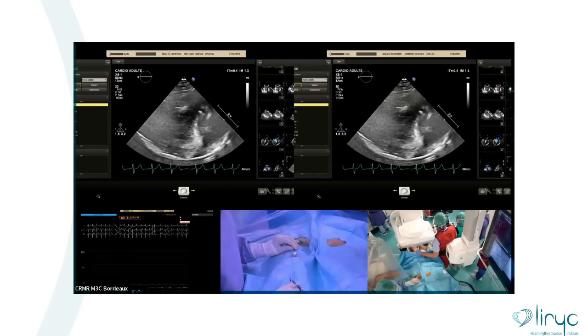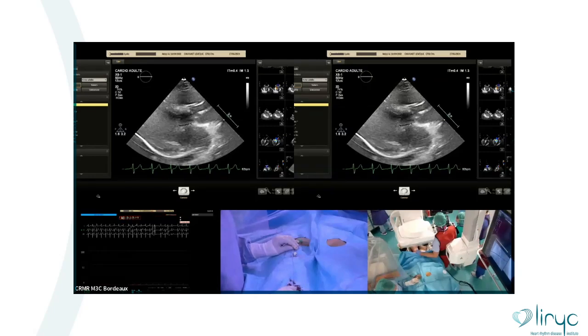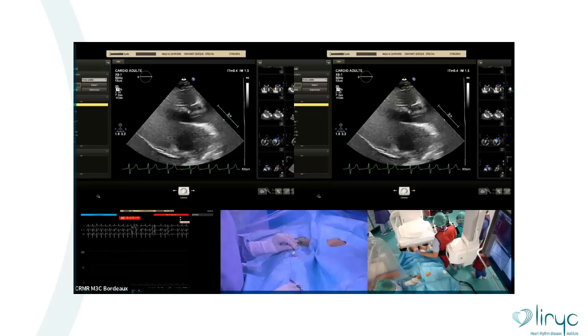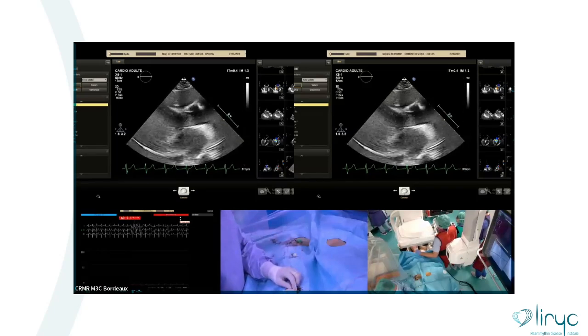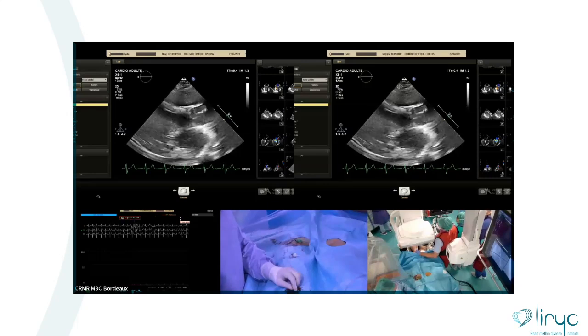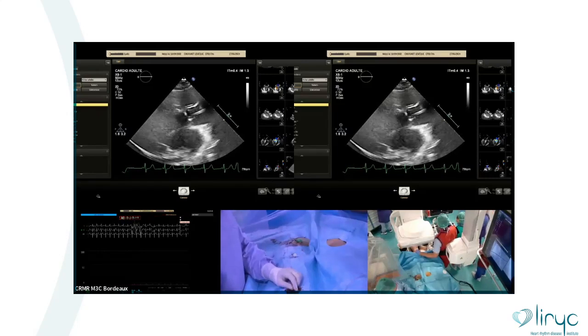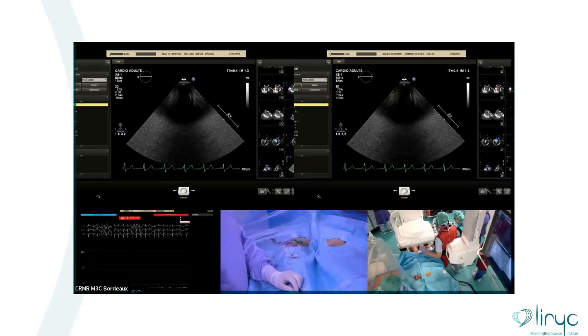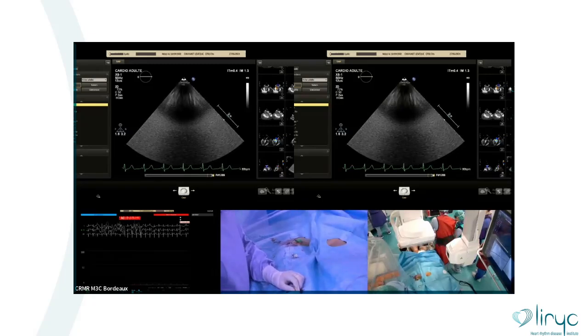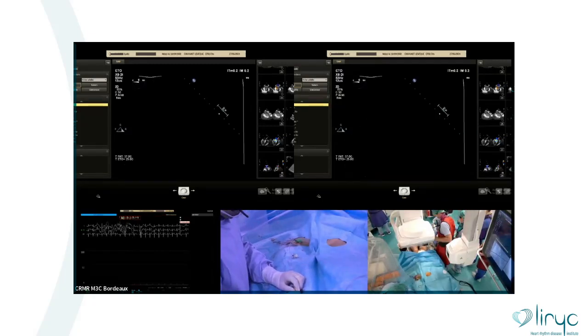Just a little past the aortic valve, because the VSD is very high, very close to the aortic valve. If you prefer to switch to TEE, let me know, guys. It's up to you. Actually, TTE is enough to see. Vas-y, passe en entier, on voit mieux, parce que je vois pas grand-chose.